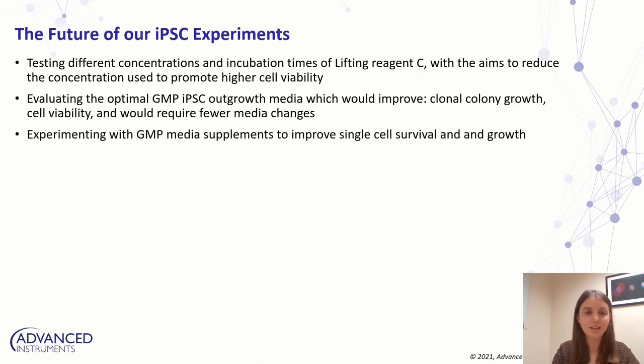Finally, I would just like to elaborate on some of our planned future iPSC experiments. Firstly, we would aim to further investigate lifting reagent C, with the aim to reduce the concentration that we use alongside the incubation time to promote higher cell viability and therefore clonal outgrowth.